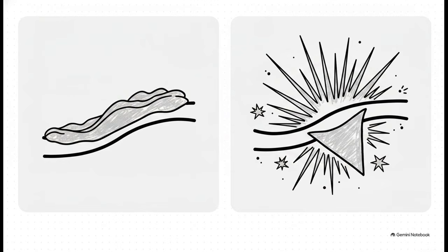And you know, the bone surface reaction? It literally tells you the tempo of the disease. A thick, wavy, uniformly dense periosteal reaction means the lesion is growing slowly enough that the construction crew can actually lay down solid new bone to contain it. But if you see a spiculated sunburst pattern, a laminated onion skin look, or a Codman triangle where the periosteum is basically lifted up like a tent, that means a malignant, aggressive process is completely outrunning the bone's defenses. The periosteum is being ripped up way before it can even consolidate.